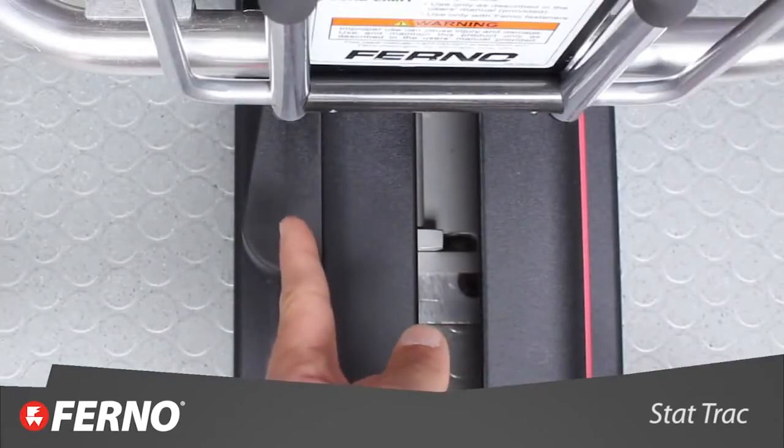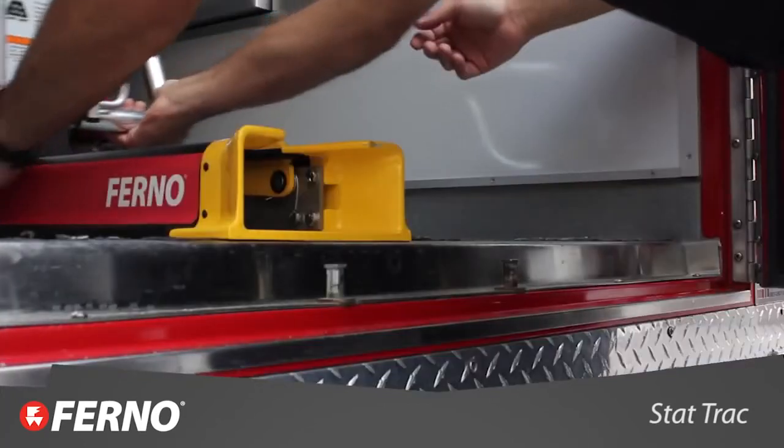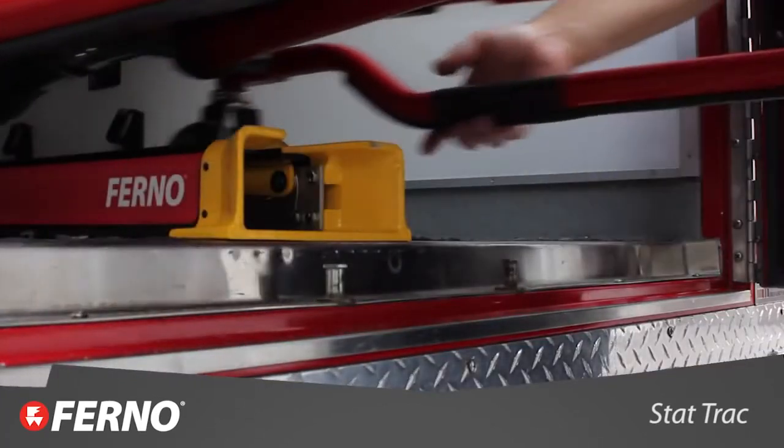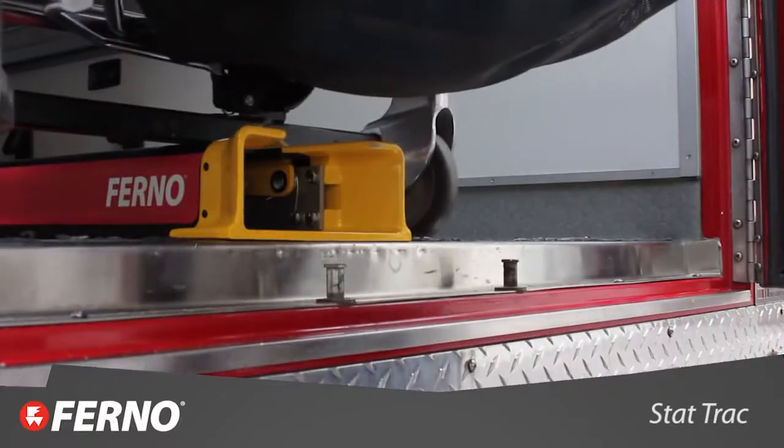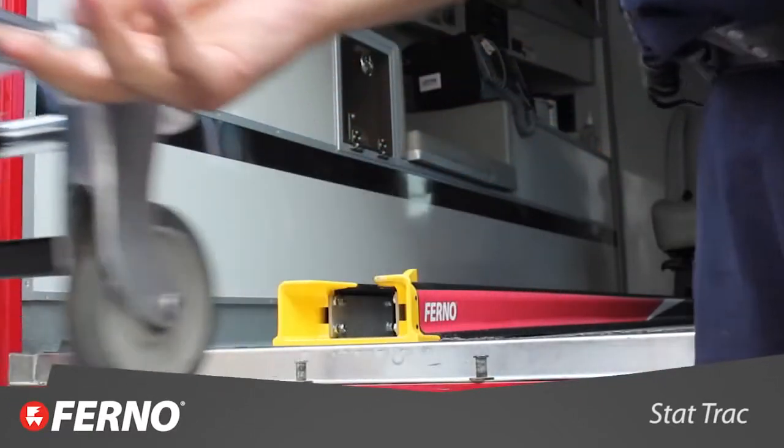To unlock the stat track, pull the lever towards the doors, slide the cot to the right, and pull the cot out until it catches the safety hook on the crossbar. The undercarriage will come down. Make sure the legs are locked into position and release the cot from the stat track.